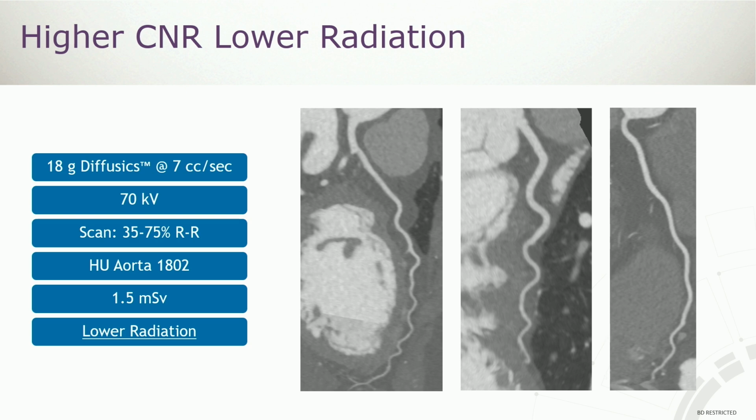This was another patient. This was not someone done for a coronary anomaly, but this was a 50 or so year old patient who was done for routine chest pain, stable chest pain in the office.